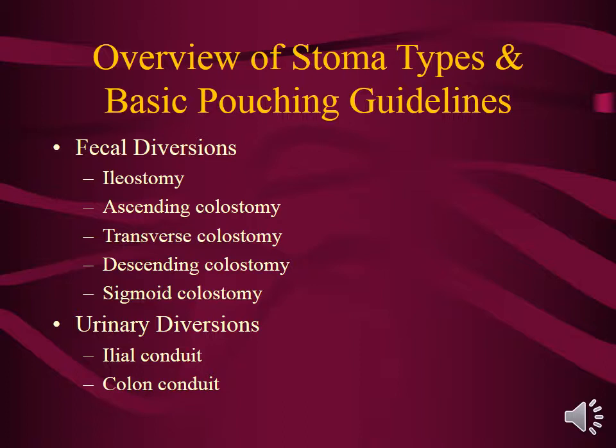Now, if you move up, the ascending colostomy, the effluent starts to get a little bit mushier, but it's still pretty fluid in content. Also, not a lot of odor or gas going on here. Still looking at needing paste or paste strips.